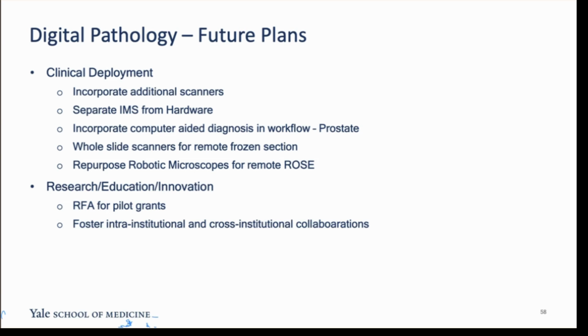It used to be that a lot of scanners would come with their own viewing software, but I think we are beginning to see that the hardware people want to just concentrate on the hardware and leave the image management part of it to the software folks. And we are seeing more and more cross-compatibility. So we think going forward, we will separate our hardware components and the image management solution.